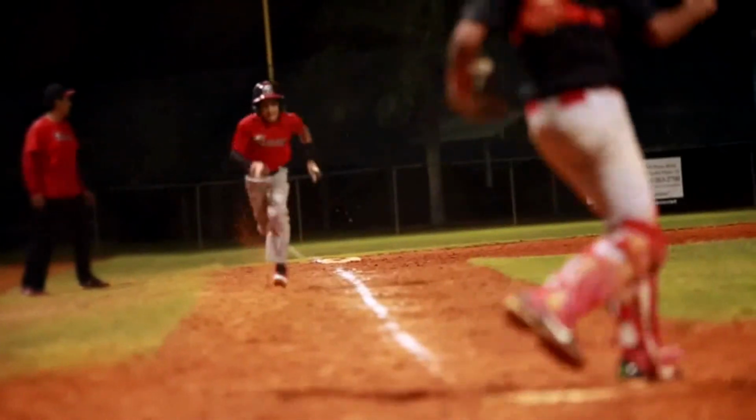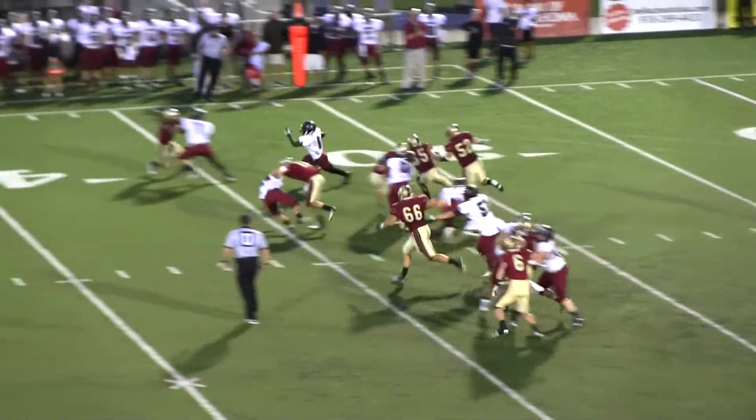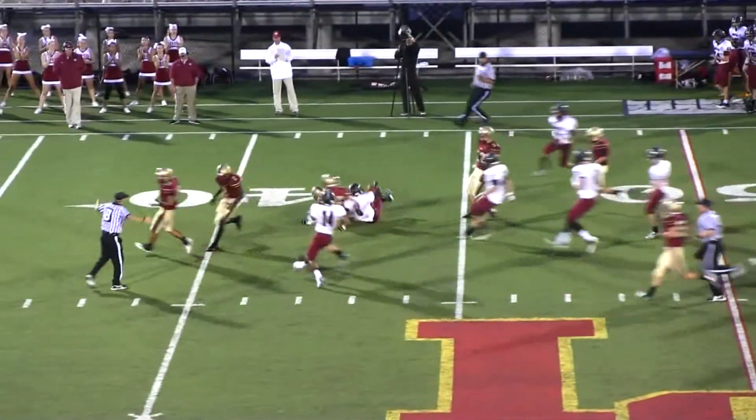With aligners, you really don't need any extra protection. You can participate in any sports as usual. If you do have a removable appliance in your mouth, we do ask you to take out the appliance whenever you are in practice or during a game, and then when you're back at home and you're not doing the sport, you put it back in.